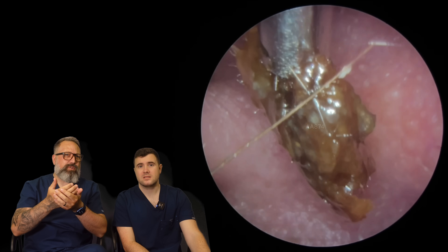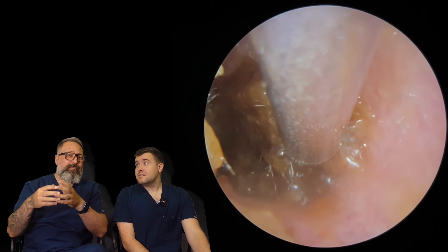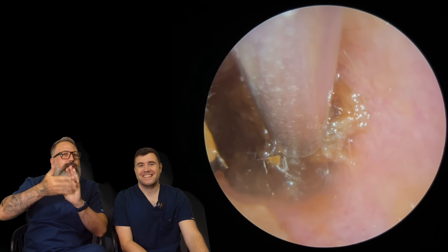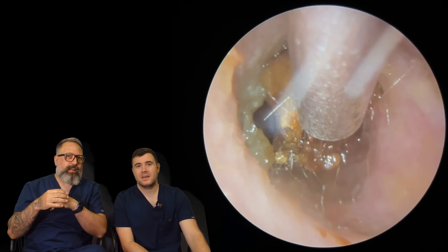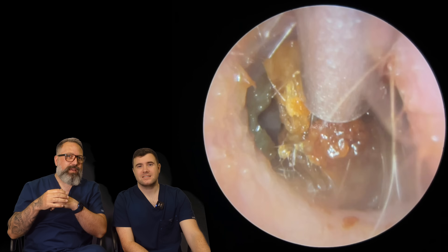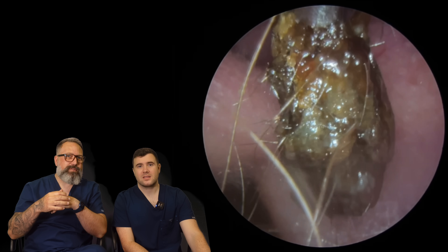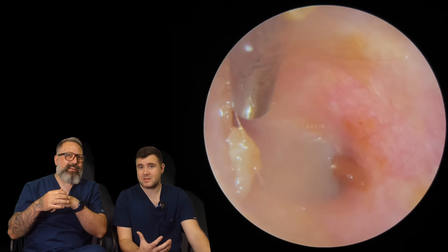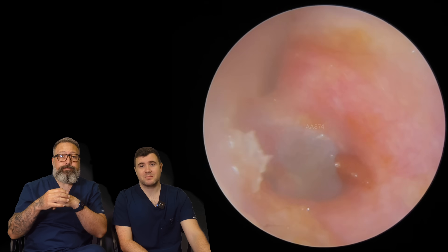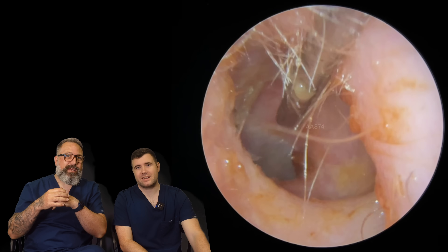It's almost like — what do you call it in geology — strata, where there's like different layers. It's a bit like strata — these layers of different types of wax material and debris in here. Look at that coming away. It does look like there's a little ring of keratin a bit further in. There we go, out that comes. Yeah, it's really deceiving, the wax. Most of the time you can tell what the consistency is, but sometimes you can't, just by looking at it. Sometimes it'll look like a hard block and then you start suctioning it and it's just wet and dark.